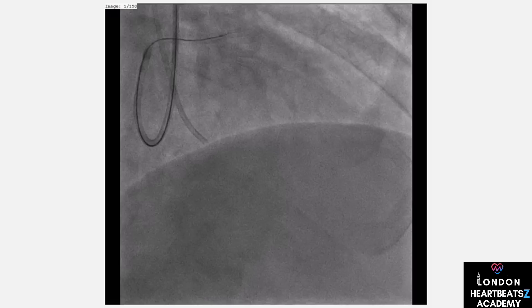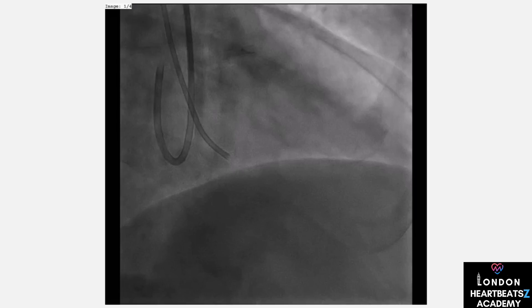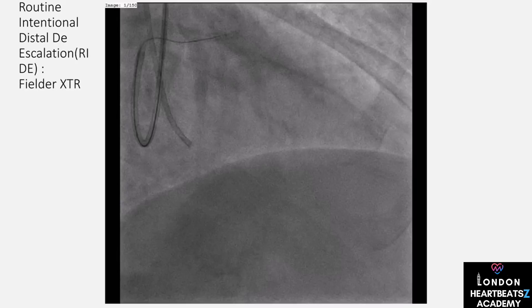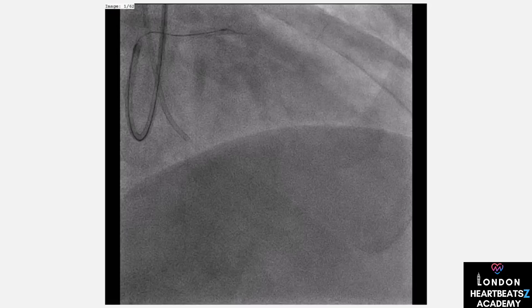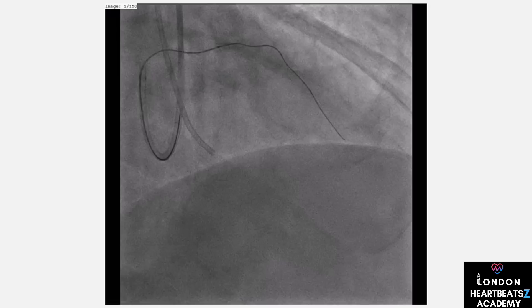Often, we need a combination of wiring strategies to conquer a CTO — like using different tools in a toolbox to fix a complex problem. Each case is unique, and our approach must be flexible and adaptive. For puncturing through the occlusion, we use the Confianza Pro 12 wire, which is essential for tackling challenging segments.